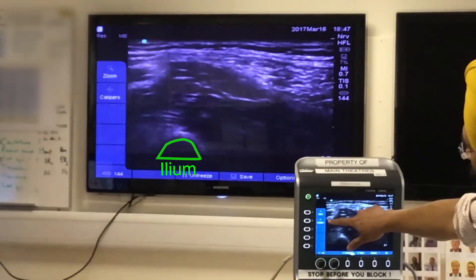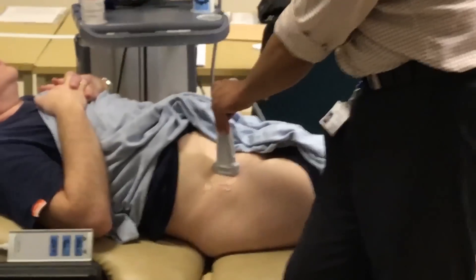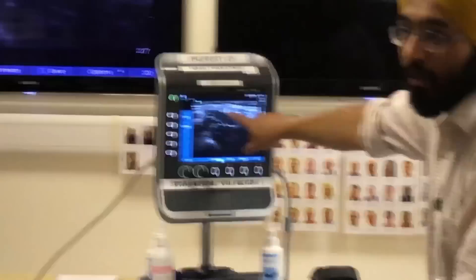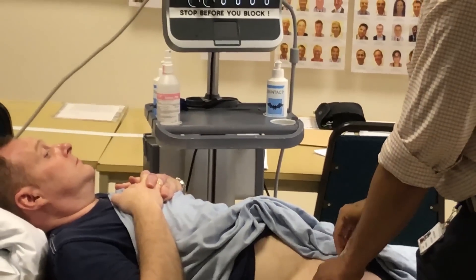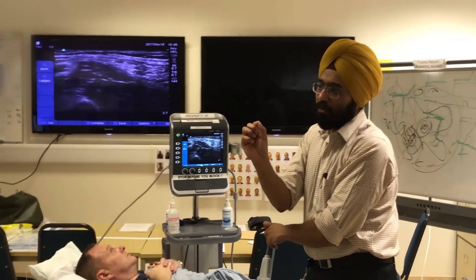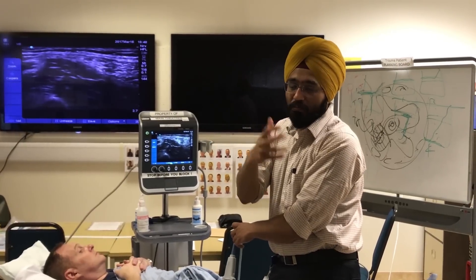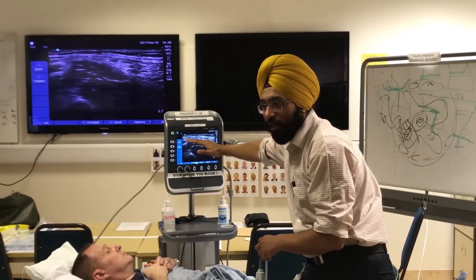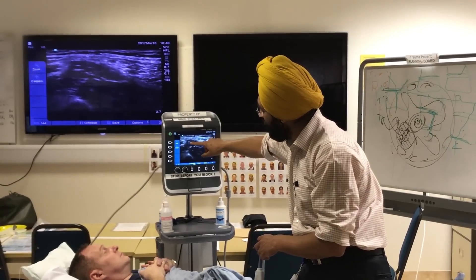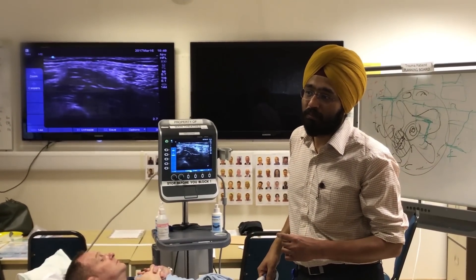This layer over the iliacus muscle is your fascia iliaca. With my probe here, if I get a needle coming through sartorius and in right here, all I need to do is just pop that layer and then get in. When you actually pop the layer, there's a natural tendency for the needle to overshoot by a couple of millimeters, so just bring it back by about a millimeter. A characteristic test - which we did this afternoon - is that you put just a little local anesthetic and you will see the iliacus being peeled off and going down. Keep your needle inside the pool of local anesthetic you've created and put about 40 mils of quarter percent marcaine or ropivacaine. It's as easy as that.